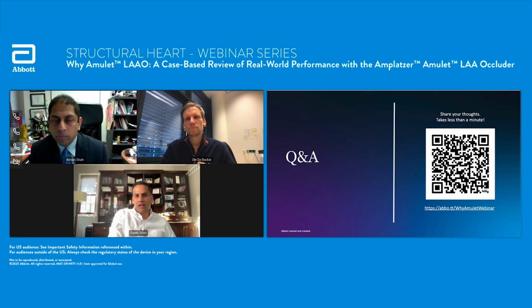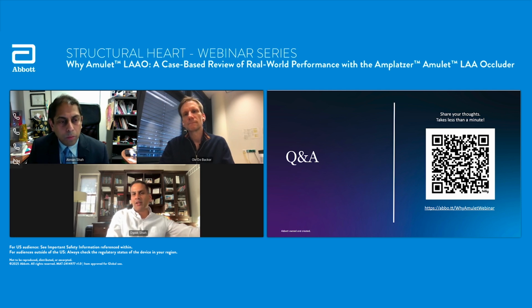Right. I have to say, Dr. Dipak made a perfect comment saying, look, with the Watchman, some of his implants were okay. That's what we've been used to because it's been out in the US longer. Like those anterior trabeculations or pectinates, we have told them for a long time, that's the best you can do, leave them behind.